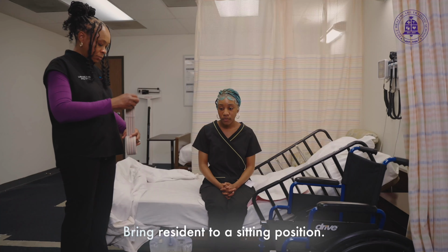Bring resident to standing position. Assist resident to pivot in a controlled manner that ensures safety. Lower resident into the wheelchair in a controlled manner that ensures safety. Remove gait belt.